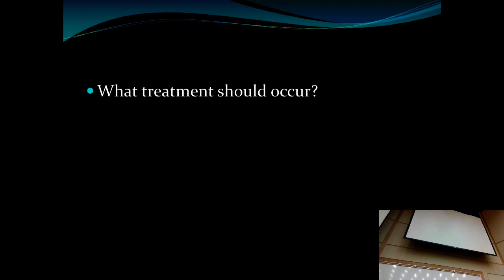Yeah, we need to call a neurosurgeon, right? So we need to evacuate the hematoma, and so they can create a hole in the skull and evacuate that. And this is really an emergent thing. There's some individuals that have epidural hematomas. There's no atrophy of the brain when you're young, so there's nowhere for that pressure to go. It's amazing the elderly can often accommodate a large bleed quite well just because of some atrophy and there's some space. But this patient needs urgent neurosurgical intervention.